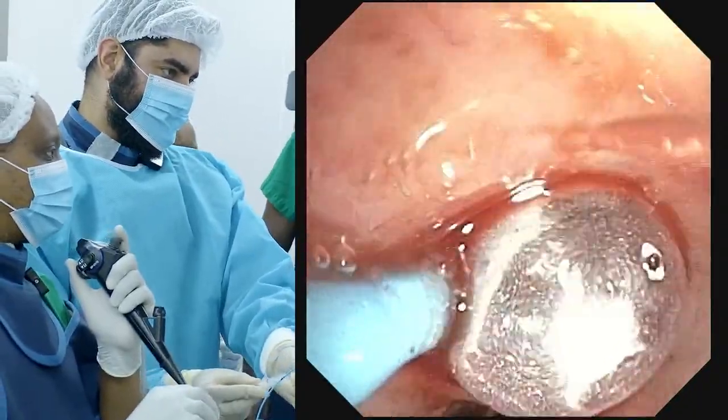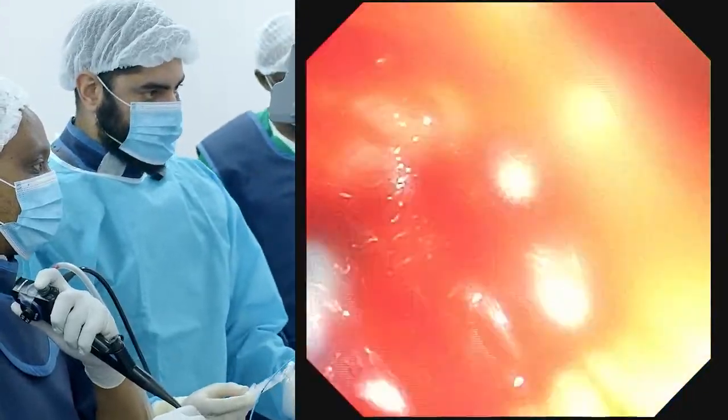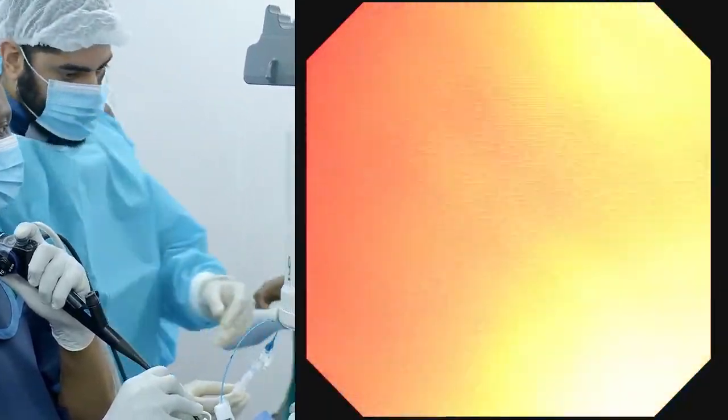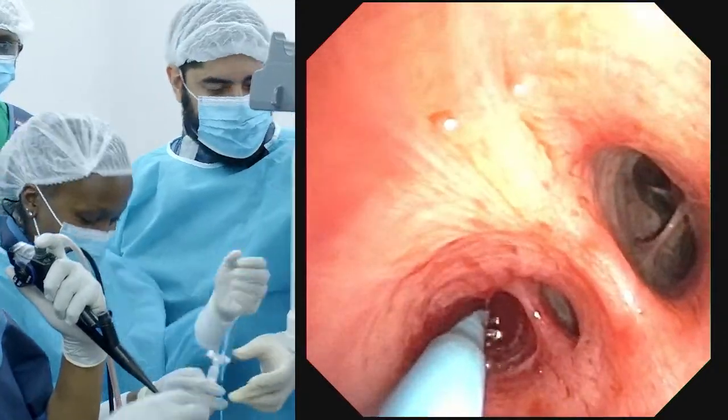Now we're going to check. You want to take a sample? Yeah, sure. So the placement's okay.